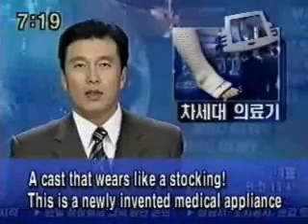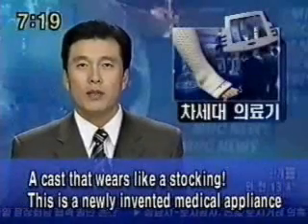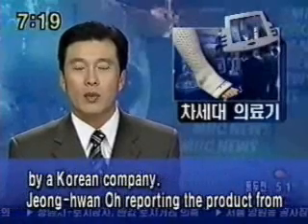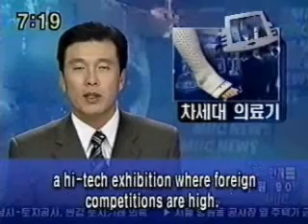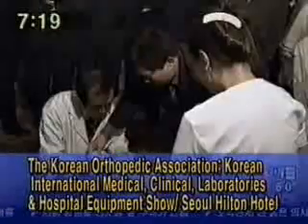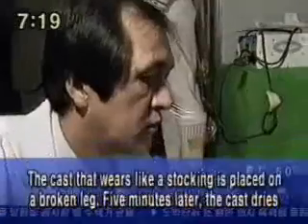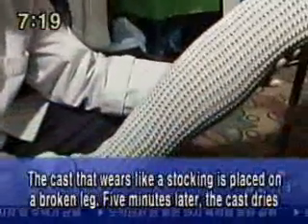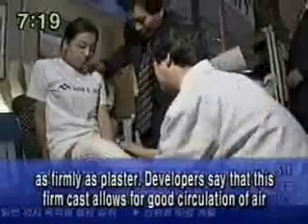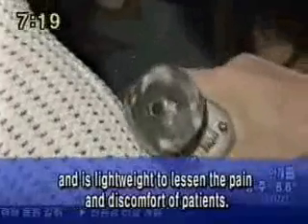A cast that wears like a stocking. This is a newly invented medical appliance by a Korean company. Jung Won-o reports on the product from a high-tech exhibition where foreign competition is high. The cast that wears like a stocking is placed on a broken leg. Five minutes later, the cast dries as firmly as plaster. Developers say that this firm cast allows for good circulation of air and is lightweight to lessen the pain and discomfort of patients.